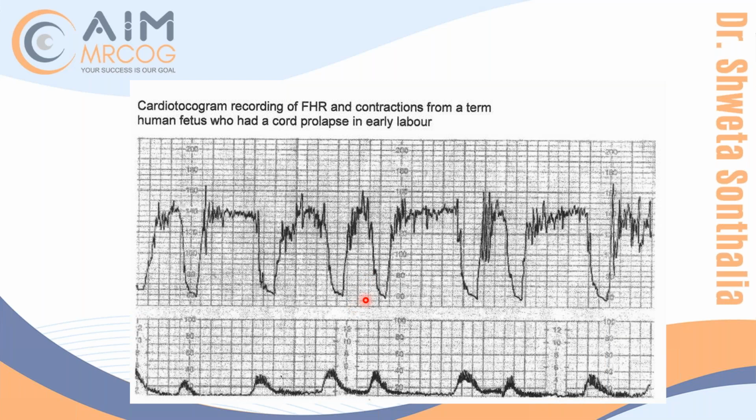But believe me, this is how I made the mistake. This is how I learned in my own course that sometimes I was mistaking other decelerations as early. If it is early, I'll leave the baby and the baby will die, because this is cord prolapse, variable deceleration because of cord compression. And with concerning features, I should act within 30 minutes.